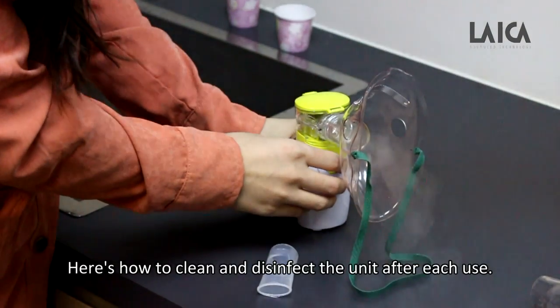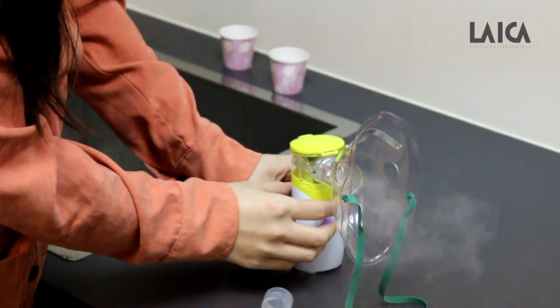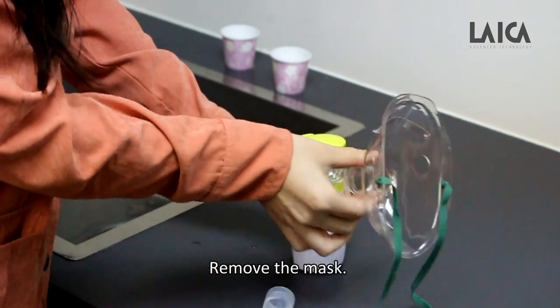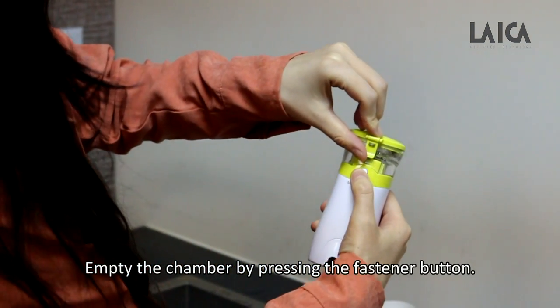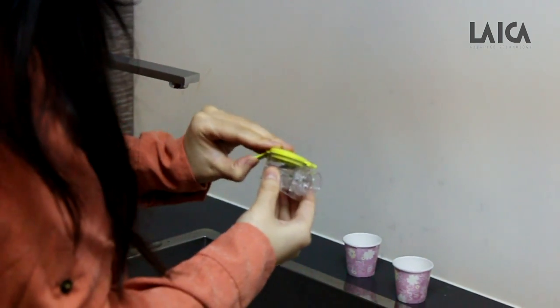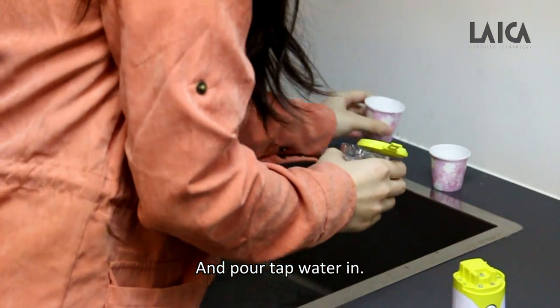Here's how to clean and disinfect the unit after each use. Remove the mask, then empty the chamber by pressing the fastener button, and pour tap water in.